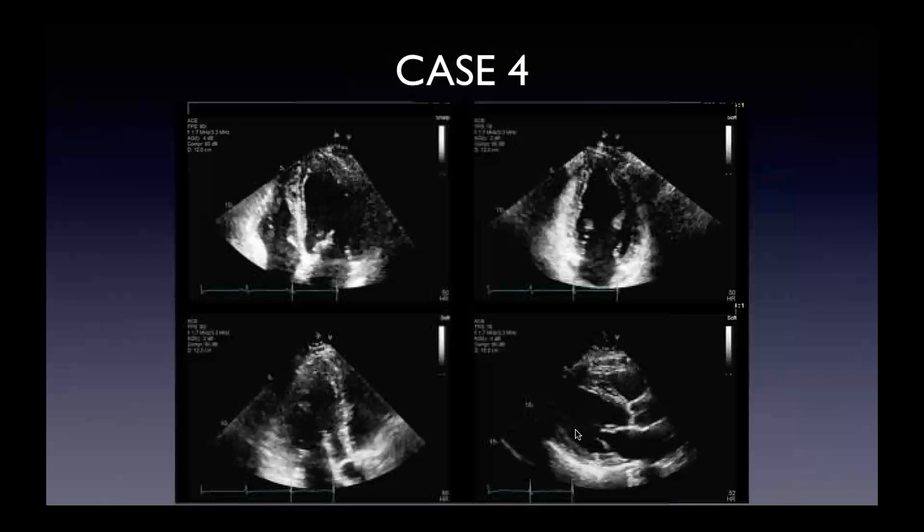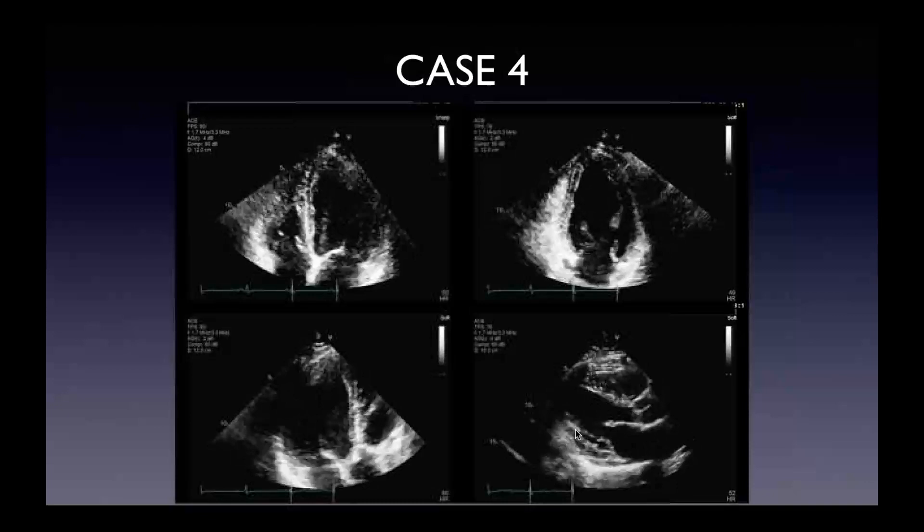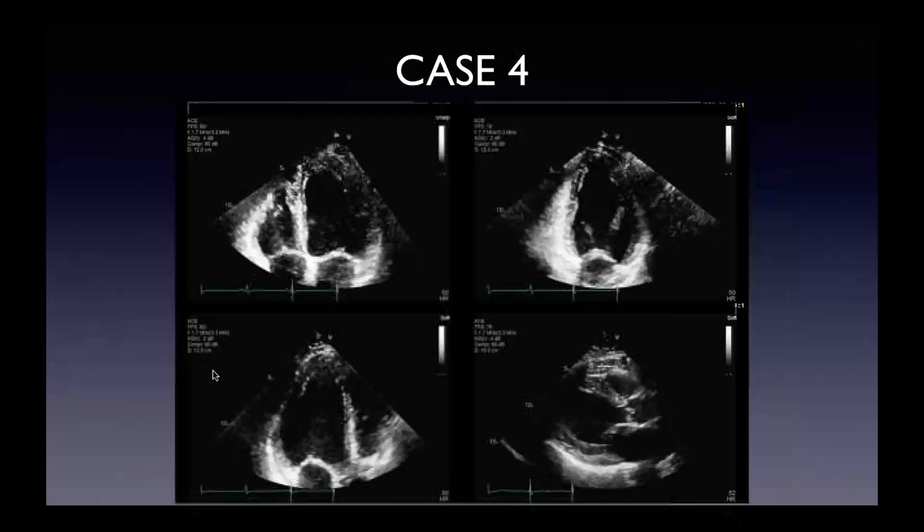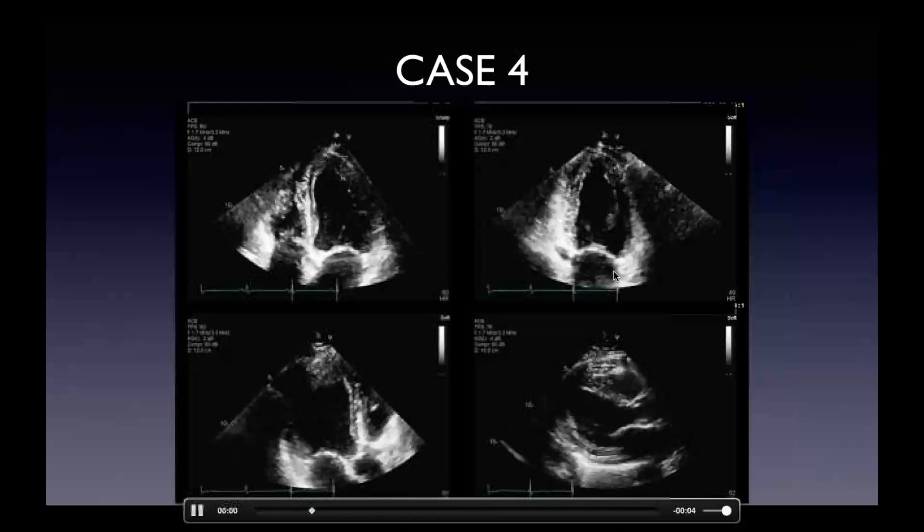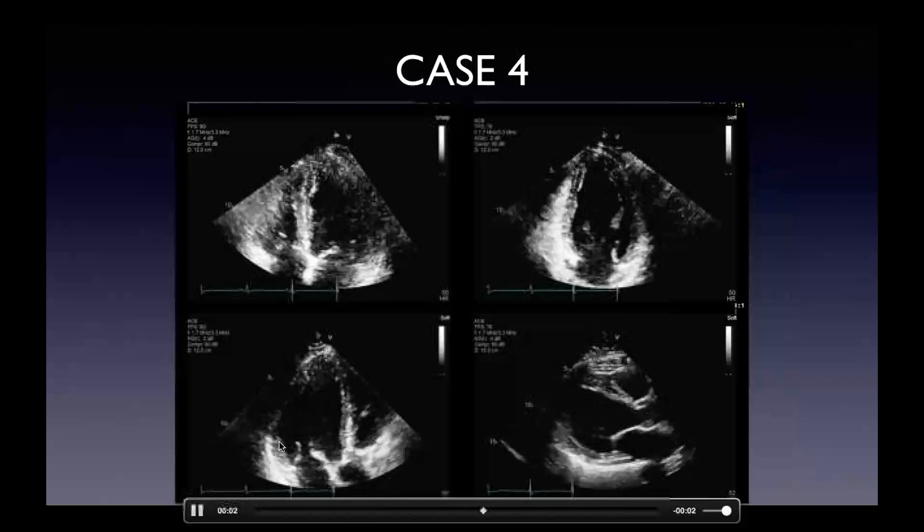Here's a fourth case — a patient with pretty decent endocardial definition. Overall maybe good enough for qualitative assessment, but probably not good enough for quantitative EF — you'd need to see a bit more of that lateral wall here. The two-chamber view is actually pretty good, not foreshortened. You lose that inferolateral wall on the three-chamber view.